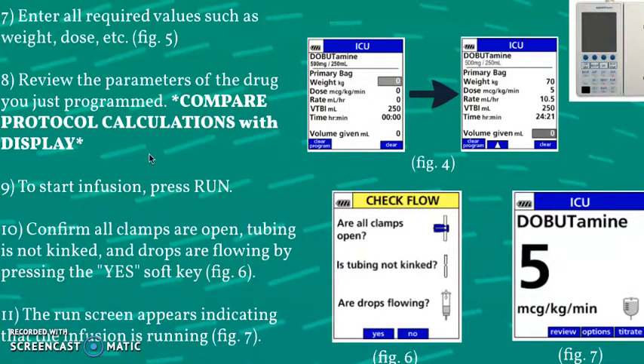You want to review these parameters and compare them with the protocol calculations you just found. This is probably the most paramount step in the whole process — given all the context on chemotherapy and drug safety, you want to double and triple check everything you're putting into the pump. The next step will ask you to confirm all clamps are open, the tubing is not kinked, and all drops are flowing, then press yes to confirm using the soft keys.